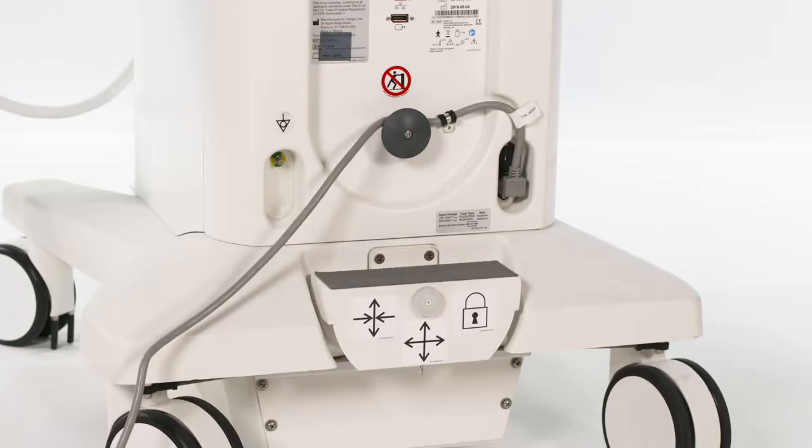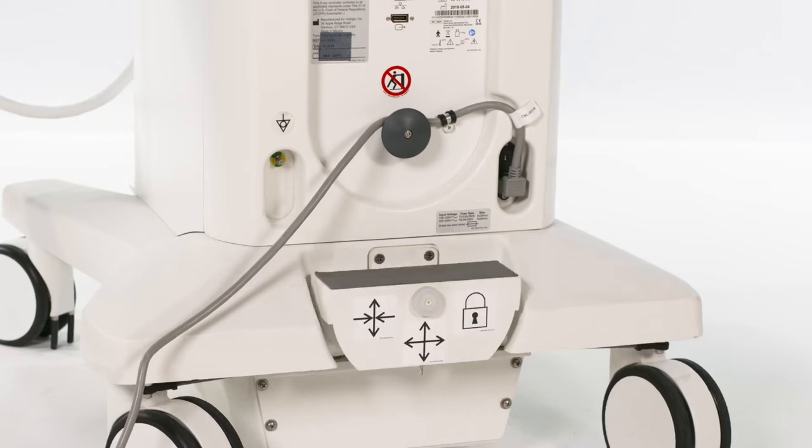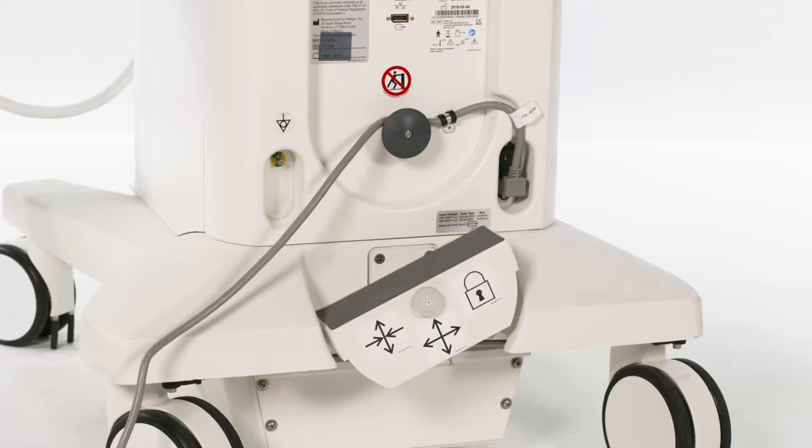The casters at the back of the machine can be used to prevent movement of the rear wheels. There are three settings: locked, free movement in all directions, and forward-back only.